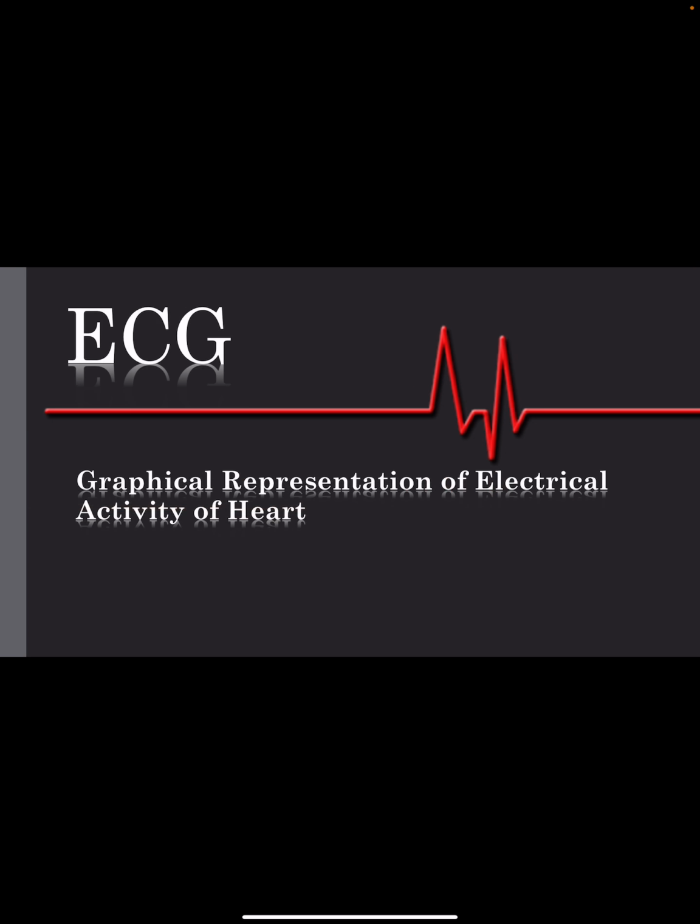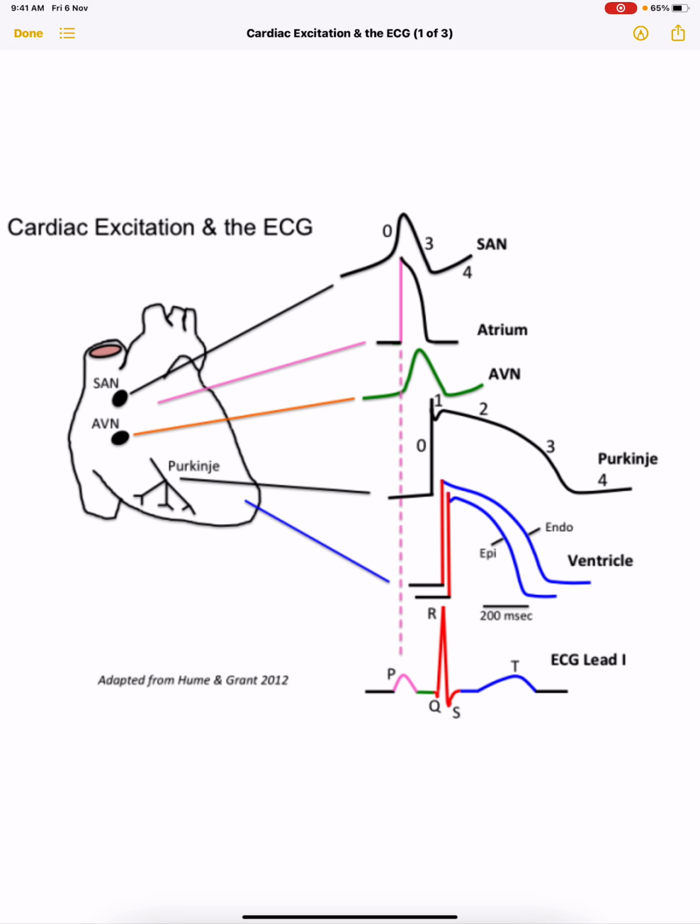I hope you remember when I defined ECG as the graphical representation of electrical activity of the heart. So in this video, we will focus on this electrical activity and discuss how this electrical activity is converted to a graphical representation in the form of an ECG. So let's take you to my whiteboard. This is a picture I took from Google. I think this is the best representation of the electrical activity of the heart.